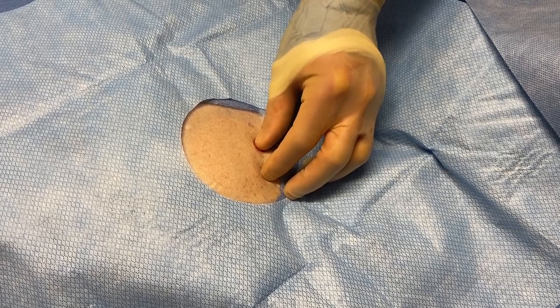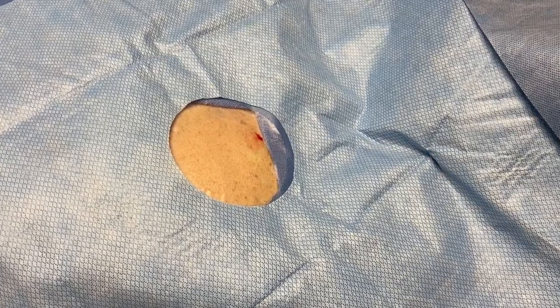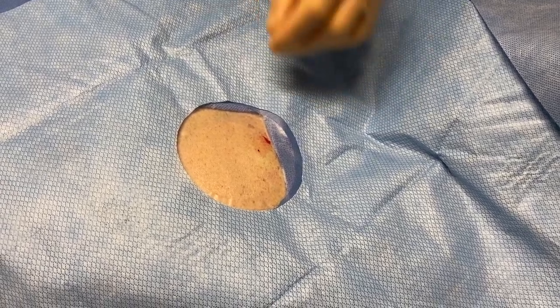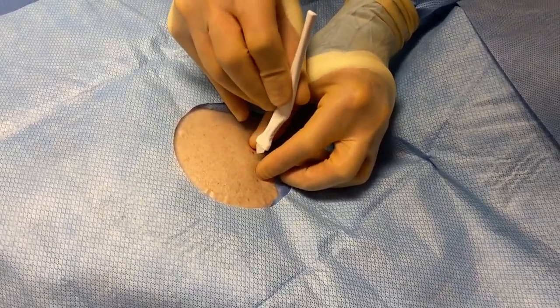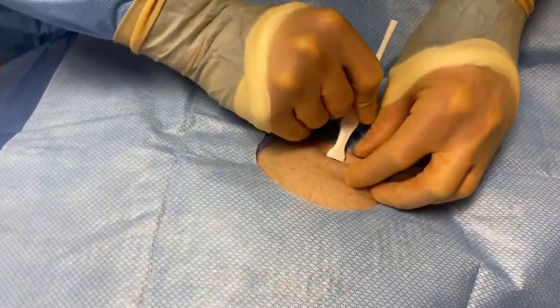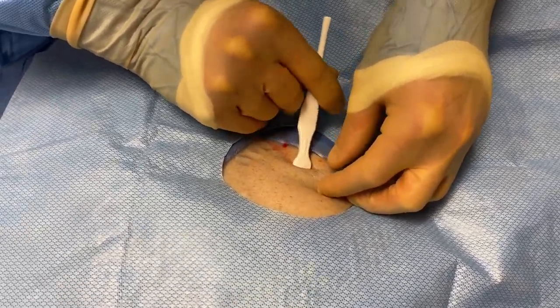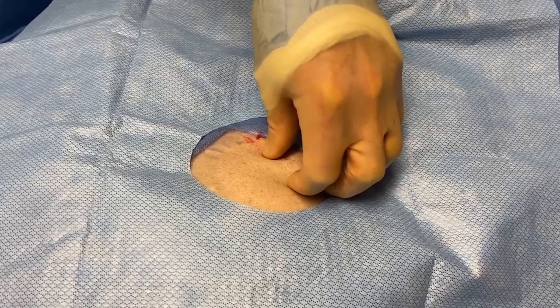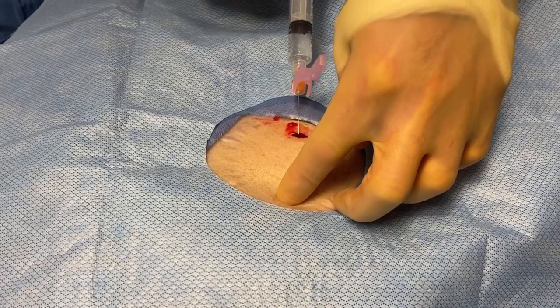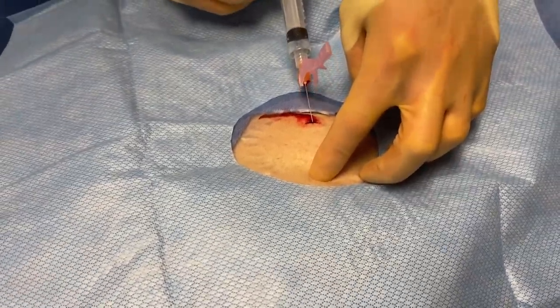And then what I like to do is, right where we anesthetized, create our skin nick with the insertion tool. And then before we deploy the device, we will infiltrate more numbing medication along the track that we're going to inject the loop recorder.